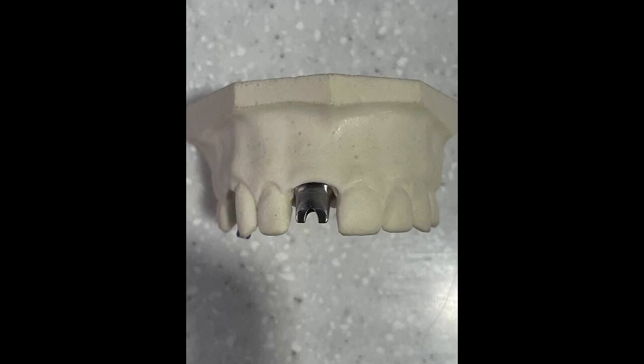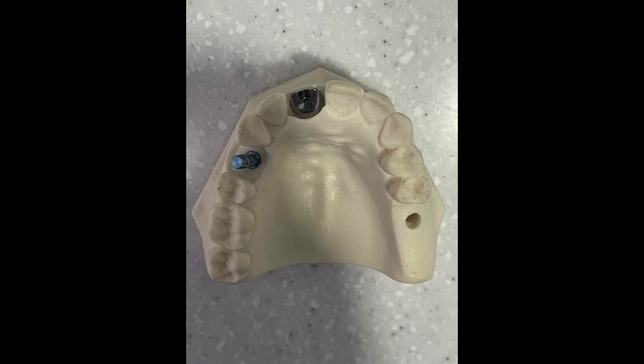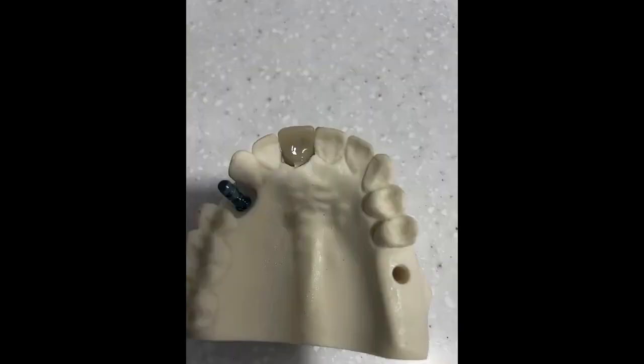Get it milled. Here is the abutment in situ, from the labial and now from the palatal aspect. You can see it's fitting quite nicely. This is from the incisal, and you can see the incisal edge is pretty much in line with the incisal edge of the other ones. The emergence is also quite nice, it's not getting in the way. And here is the crown seated. I haven't polished it or cut off the sprue as yet. And here it is from the buccal view, looking at the labial emergence, and you can see it's a nice little emergence profile there.